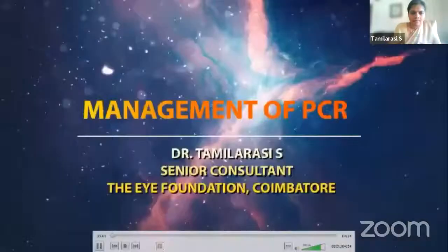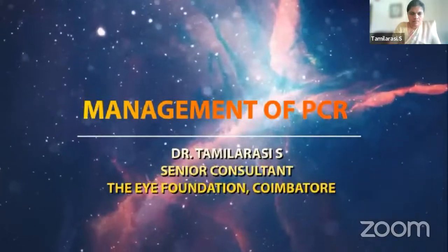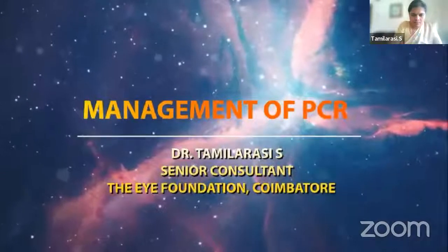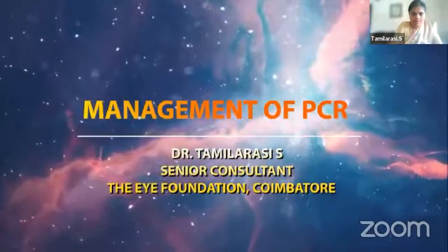Good afternoon all. Today I am going to share a surgical video audit of posterior capsular fracture managed by a junior surgeon and analyze the decision-making process, which could be of benefit for others when faced with a similar situation and hence improve their surgical performance.